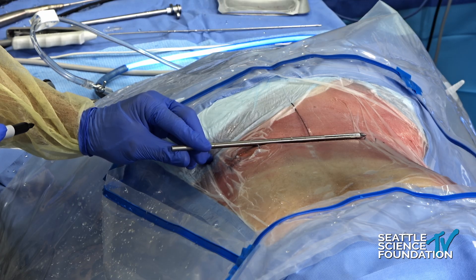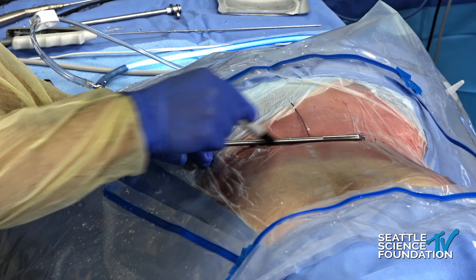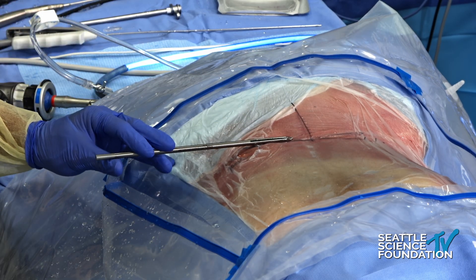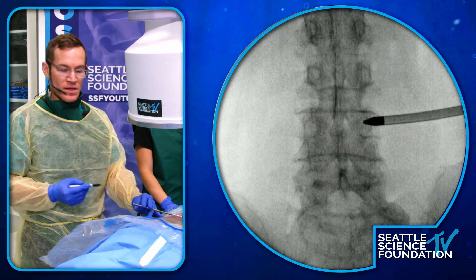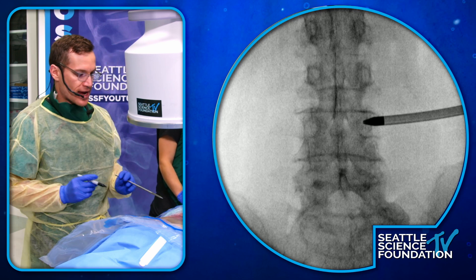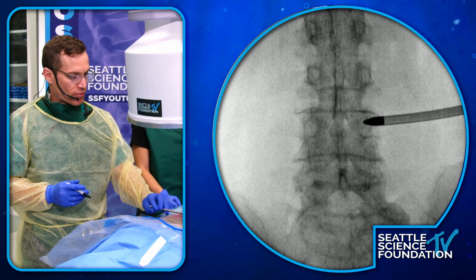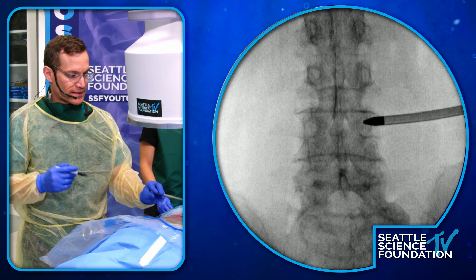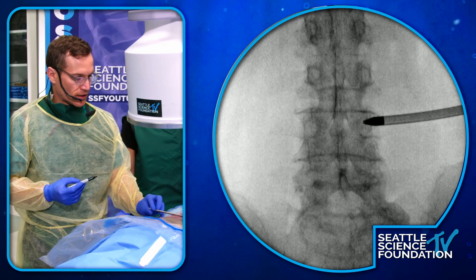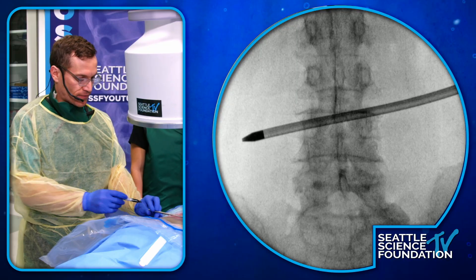Let me confirm what line this is on x-ray. That's this line right here. I also like to mark the ipsilateral pedicle because that gives me a landmark to aim for — I'll just put a little circle here. Meng's already drawn this diagonal line. The angle depends on where you're trying to get, but a slightly cranial-to-caudal angle can be beneficial. Something like that would be nice for the approach.